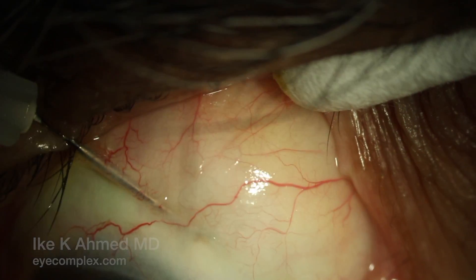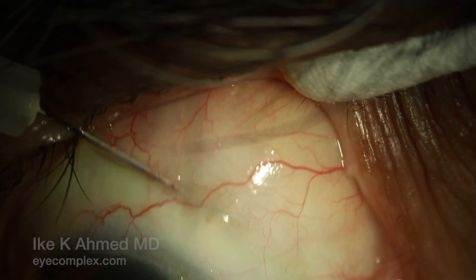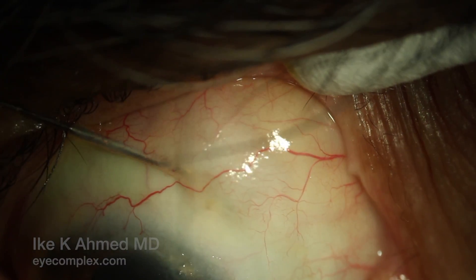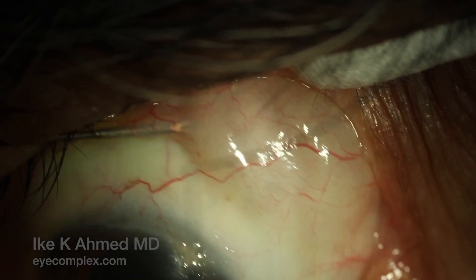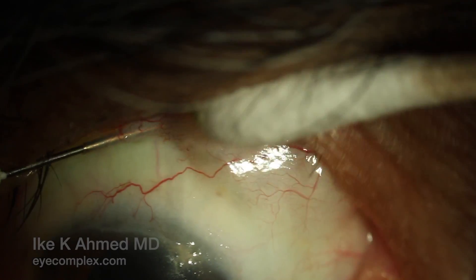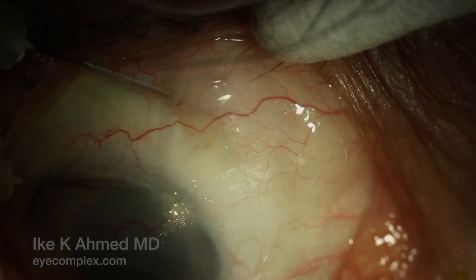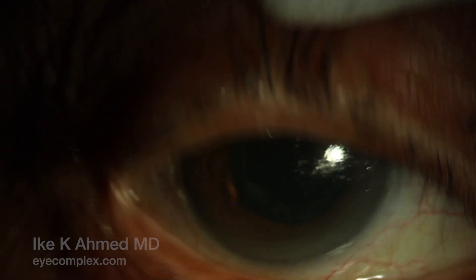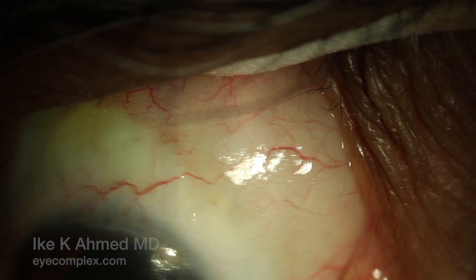Viscoelastic may be injected at this point to further separate tissue and retain the bleb for the first few days. Typically, a cohesive viscoelastic can be used, and along with the use of an antifibrotic, this can be helpful to ensure good wound healing control. Post-operative topical steroids are used vigorously for the first few weeks to control inflammation. At the end of the needling, the pressure drops typically into single digits and a bleb is nicely well-formed.